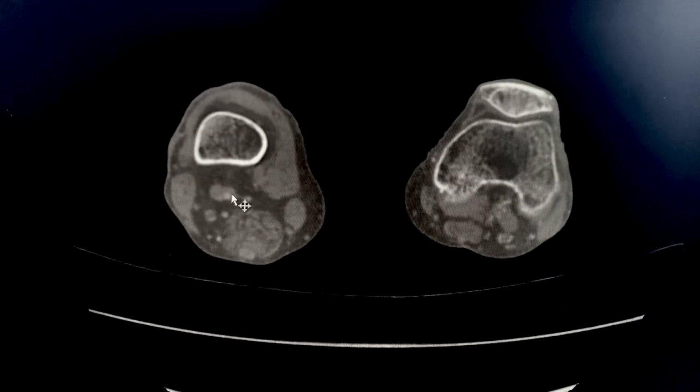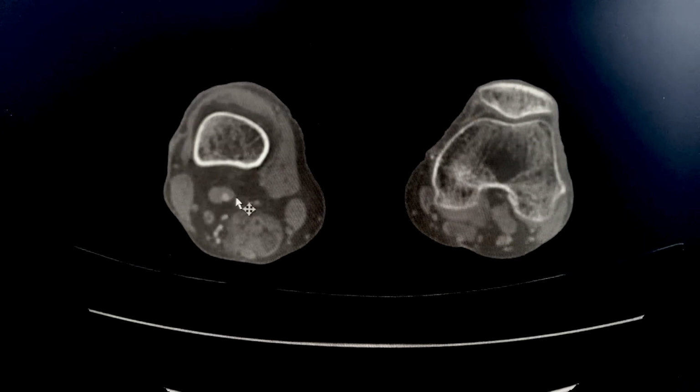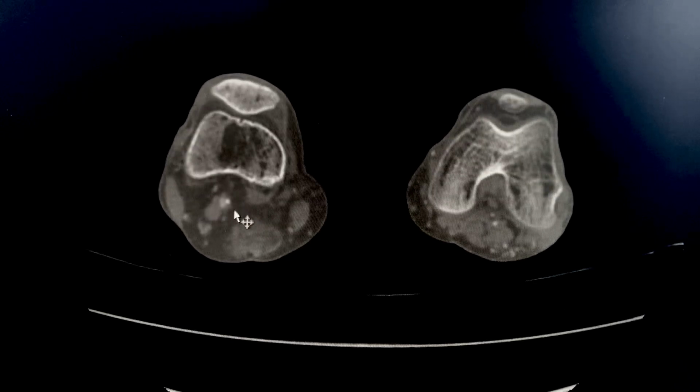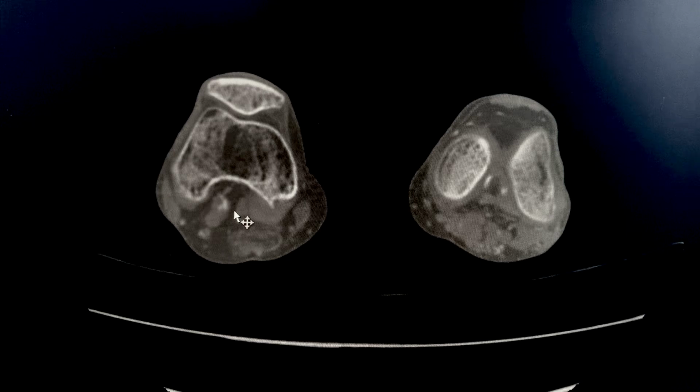All right, you can see here, this is now infrapopliteal, and this is now infrapopliteal. As you can see, the occlusion on the left, and then on the right here you have significant stenosis, hemodynamically significant stenosis, but there's also occlusion, you see. And there's also occlusion. There you go.